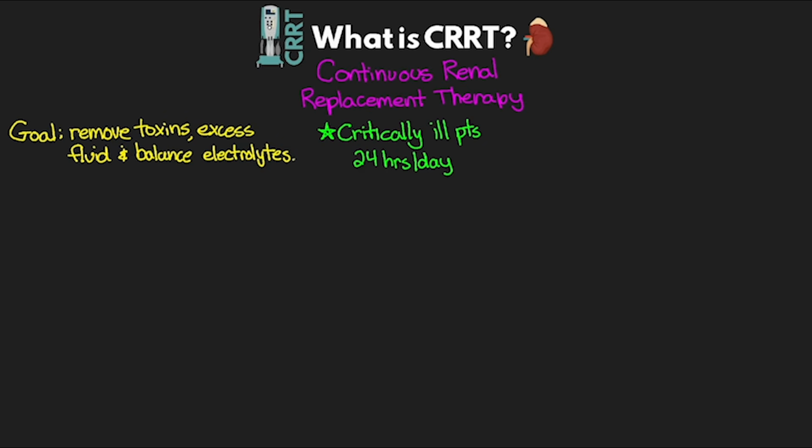Now, in order to operate the CRRT machine, as well as to take care of the patient that's receiving the therapy, it really requires specialized nurses who have been trained in this therapy, as well as the physiological impact that this therapy is going to have on the patient.